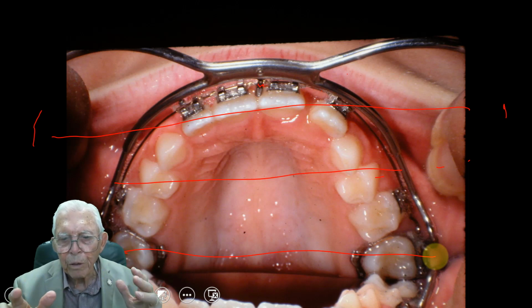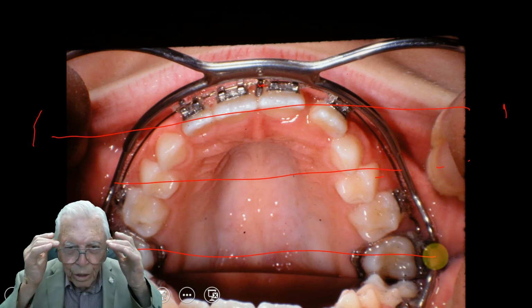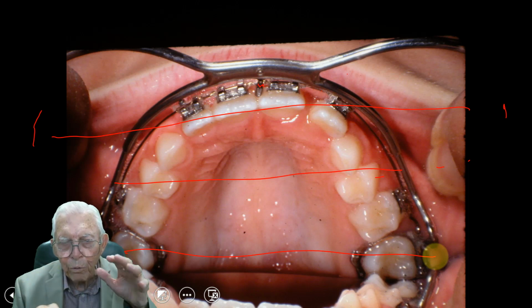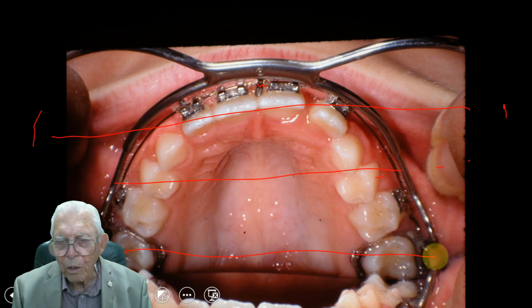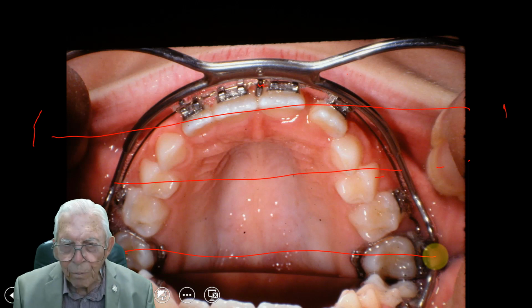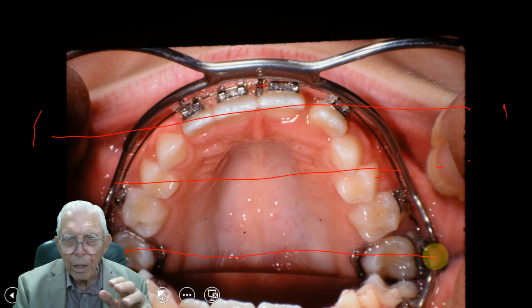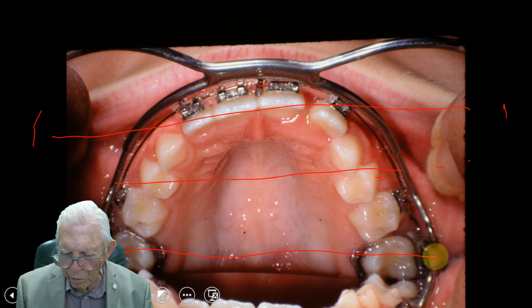So we haven't explained that on some of these headgear cases. Now this is occipital, coming down from the occipital bone like that, and you cut the arms where you pick up what you want to raise up. So if we're pulling back on the front teeth and we don't want them coming down, we can keep them raised up by using this little occipital headgear, and this bar, we had them just made with that. You put that between the centrals.